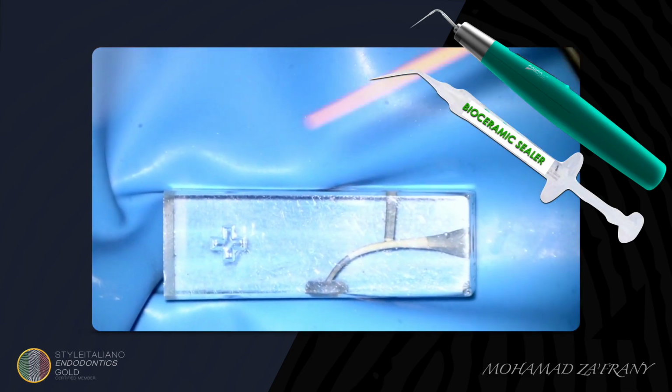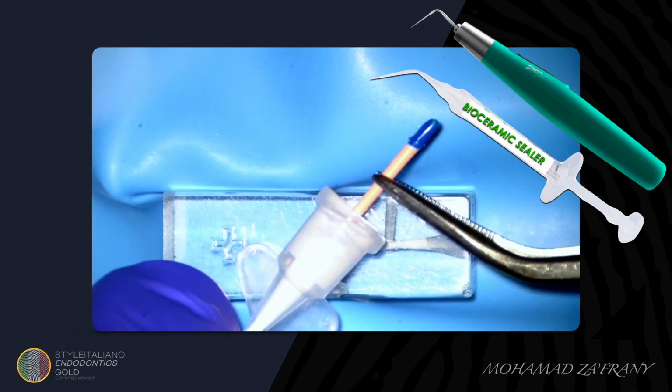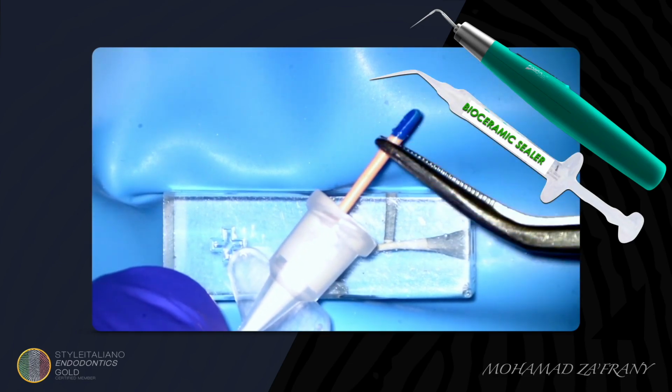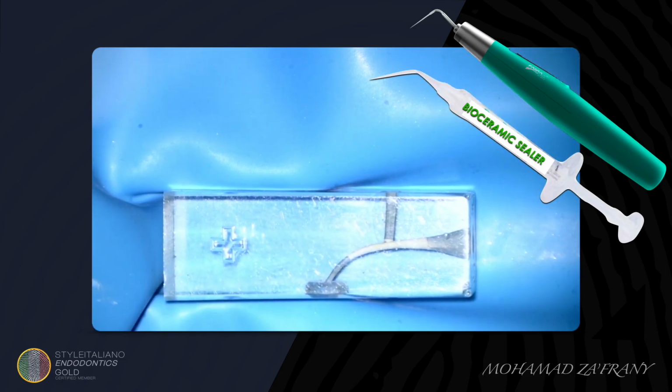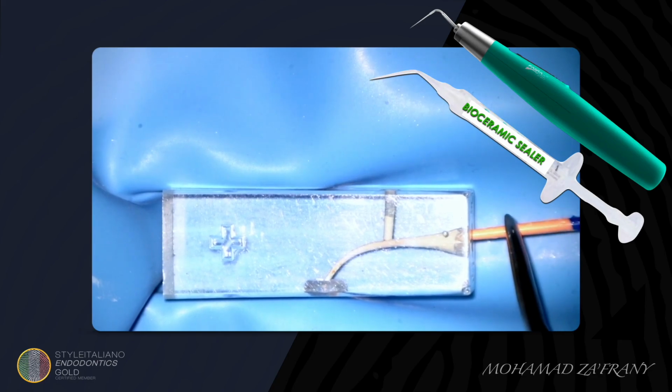We can put it on the master cone. Now companies improve the quality of the tip so there is minimal waste. Then introduce the master cone with the sealer into the canal. As you can see, it acts as a plunger and pushes the sealer into the spaces.